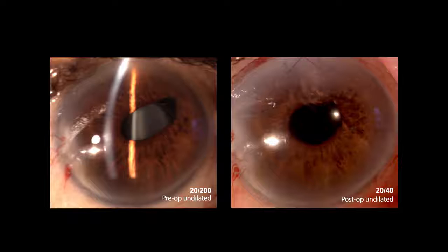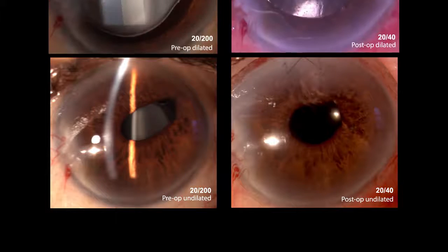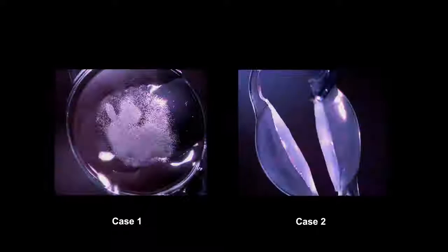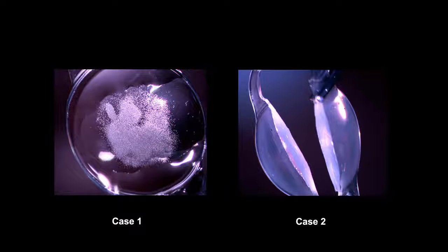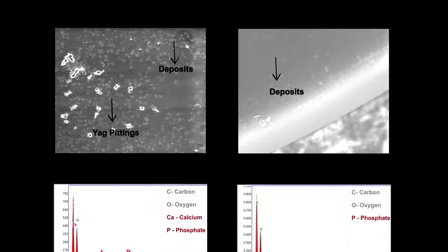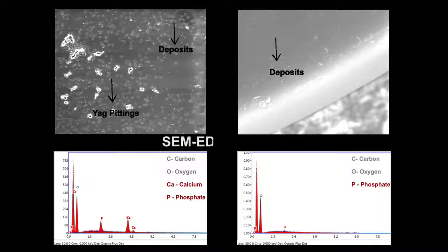Post-operatively, a relatively round pupil and improved visual acuity was noted. The explanted IOLs were then subjected to scanning electron microscopy. It revealed calcium phosphate deposits in case 1 and phosphate deposits in case 2. Von Kossa staining also showed presence of calcium over IOL.